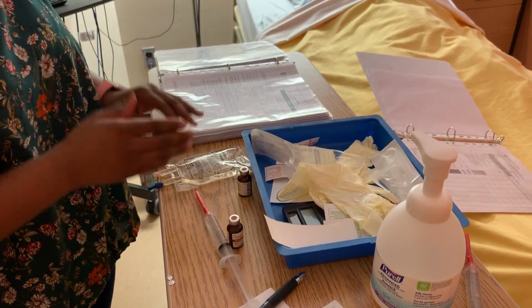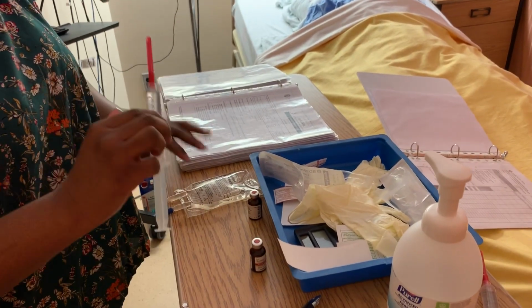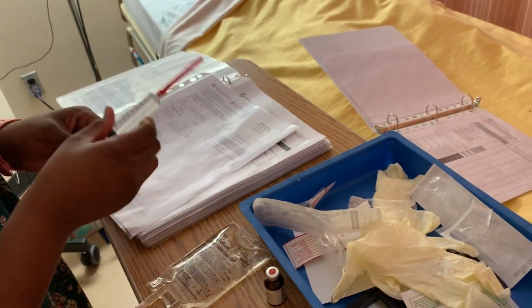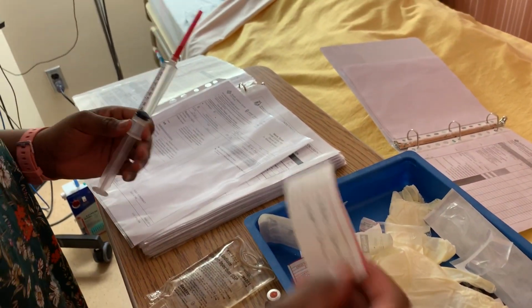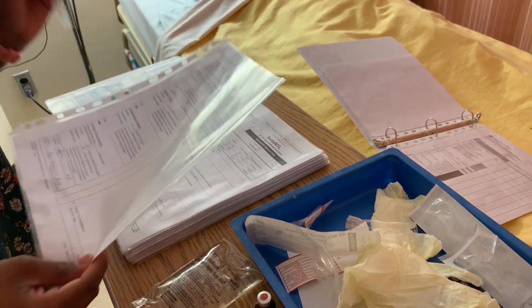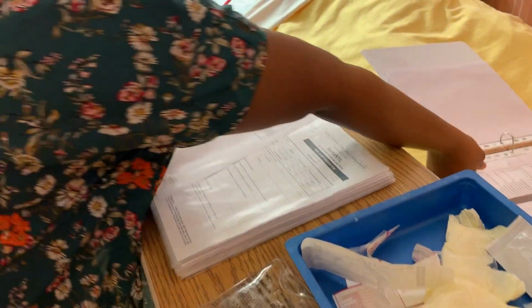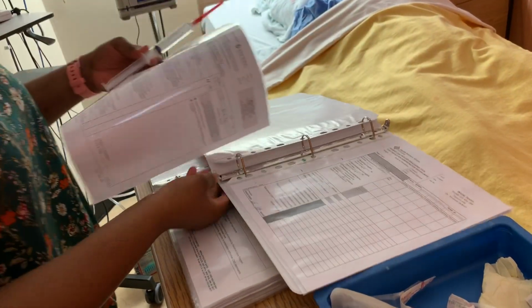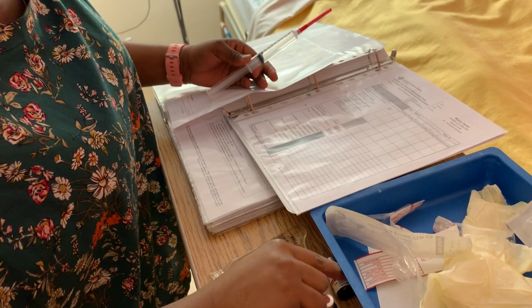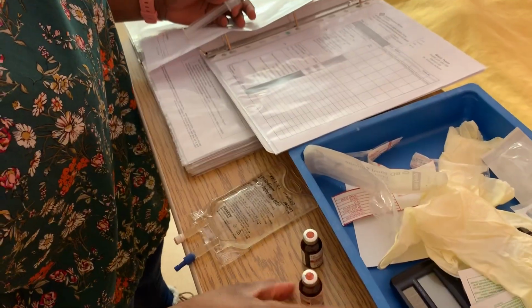So before I inject or dilute my medication in this, I'm gonna do my second check. So my second check is, so I've already written my label as well. So my second check is gonna be fentanyl, comparing as well to the MAR. So it's gonna be fentanyl 10 micrograms. So this is fentanyl 10 micrograms.